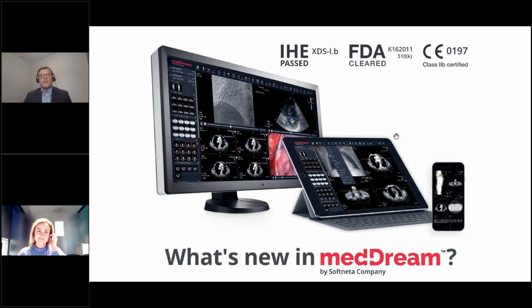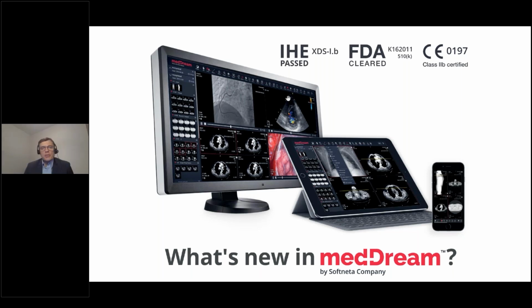Thank you, Renata, for the introduction. So let's start today. I'm very proud to say that we have the 7.8 version available for all our partners to download, test, and implement. This work was quite huge. It's not 6 months like usually. Some of the tasks were much longer, and I will present them. I believe this is a huge opportunity for all our partners to go into new segments by using Softneta technology in segments like ophthalmology. Also, other very important features are available in this version, which I believe will significantly improve the possibilities for our partners to do much more with our technology.